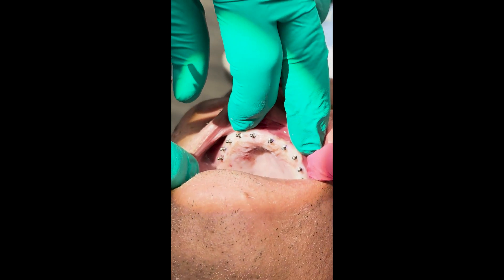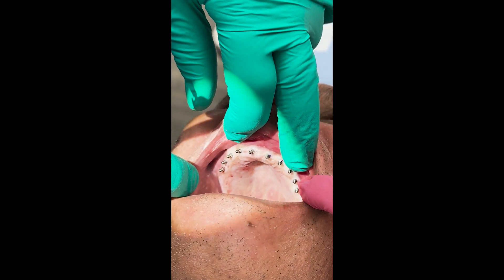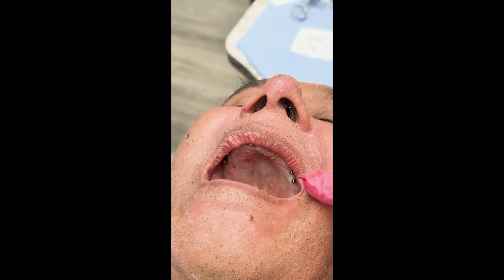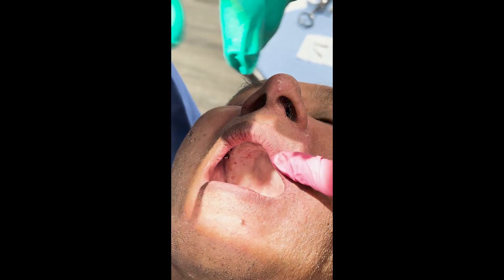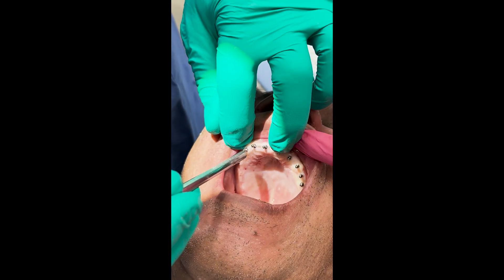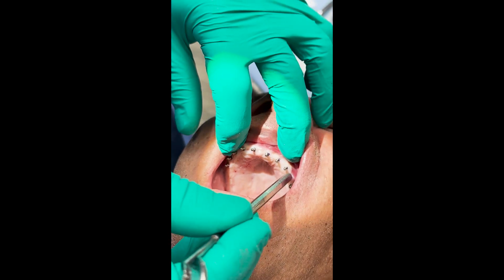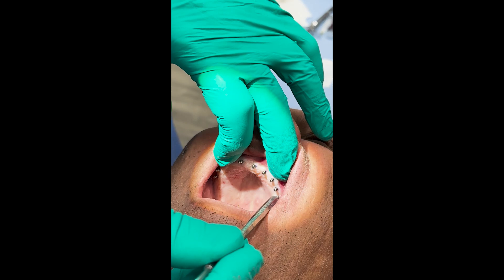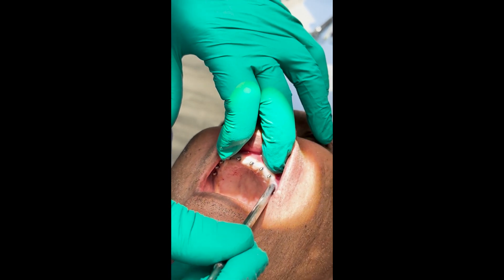So we've got 10 implants in place. Even though I torqued them, I still like to hear that nice solid sound when I tap on them. This is the only one that didn't quite torque, but it's still in there nice and solid — we should be just fine with that.